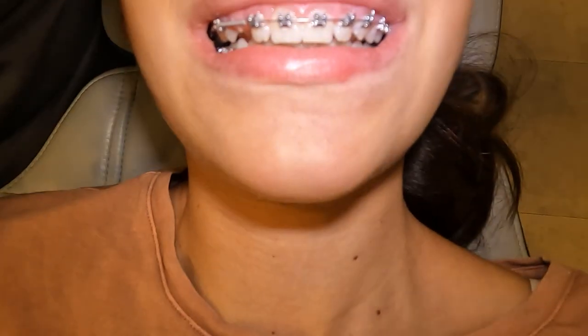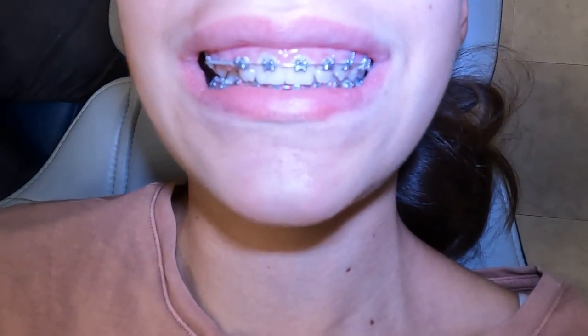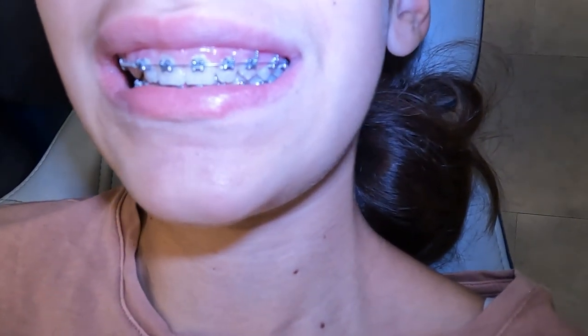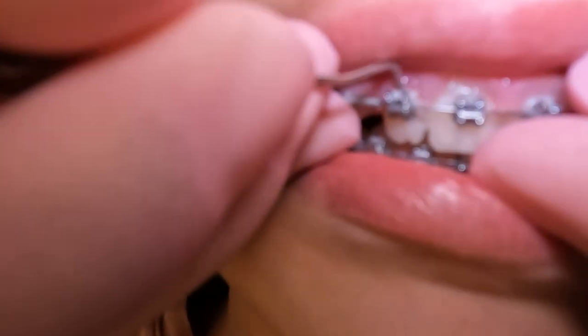Four, just like that, easy peasy. Then they go on to the bottom and take all the colors off. The orthodontic technician will do the adjustment after the orthodontist gets a chance to sit down and check it out. So we're gonna remind you: with special self-ligating brackets, they have this little clip.